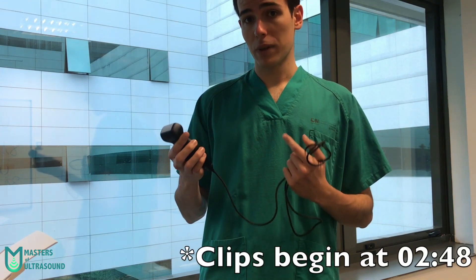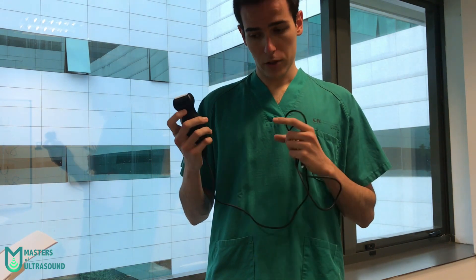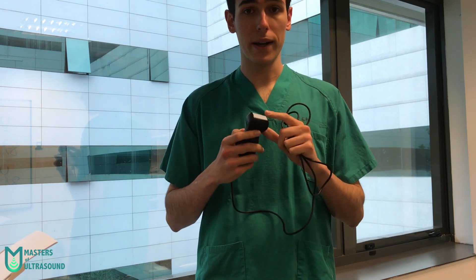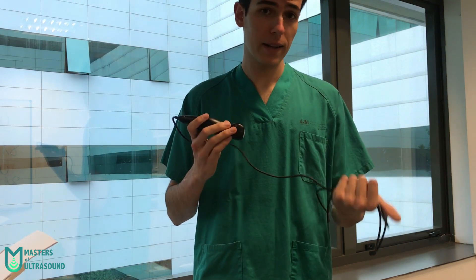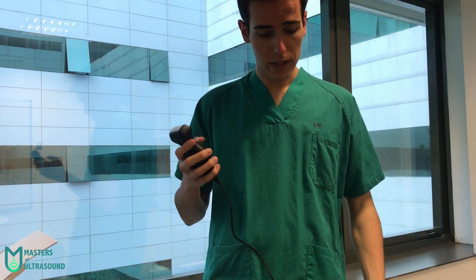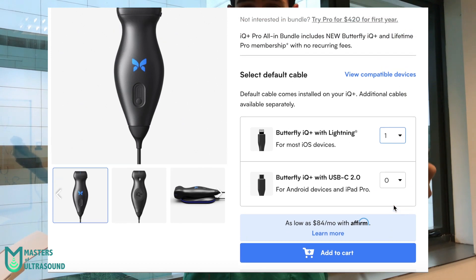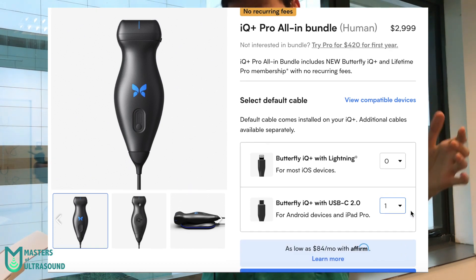The Butterfly IQ Plus is a wired device with a really wide footprint, but this is a unique probe. The GE Vscan Air that we showed you last week had two probes — a linear probe and a curved probe — and this has only one, so it uses an electronic system to adapt the ultrasound beam to linear, curved, or phased array settings. This device comes with two different wires: lightning for iPhones, or USB-C for iPad Pros or Android devices.